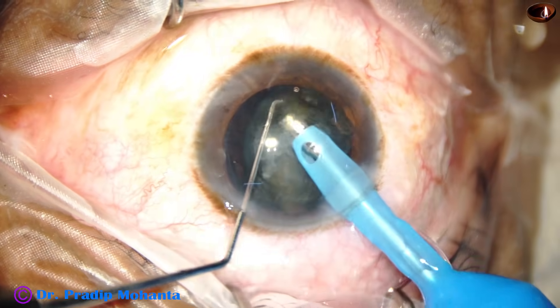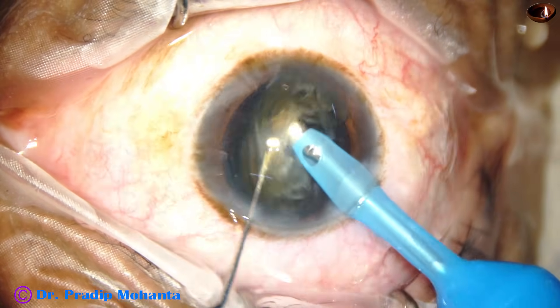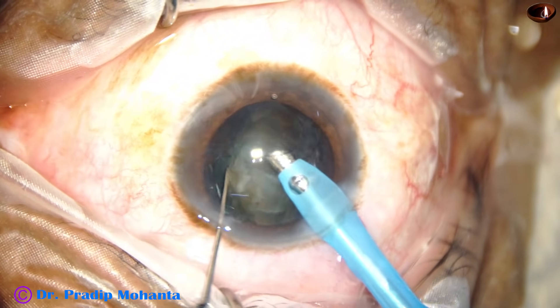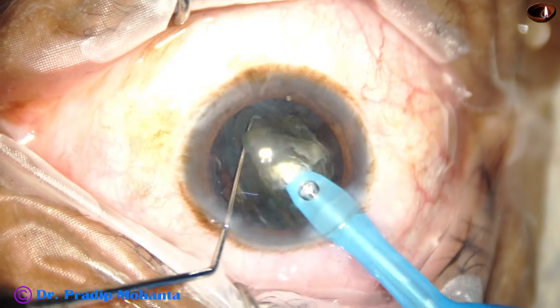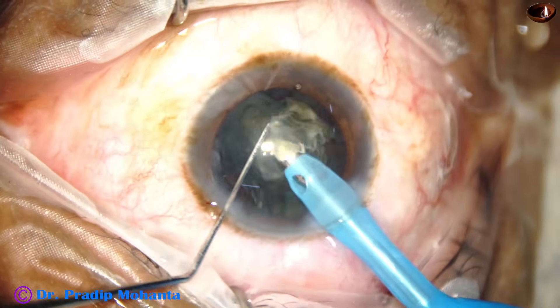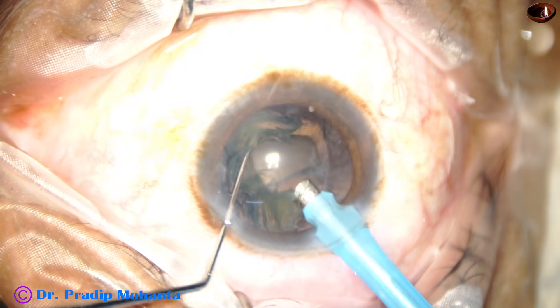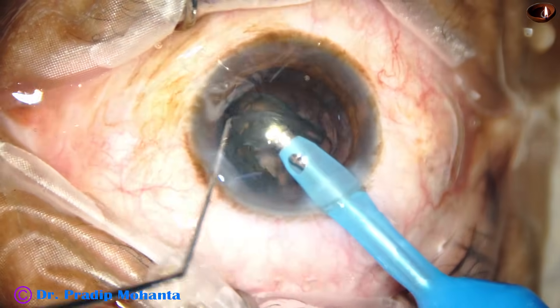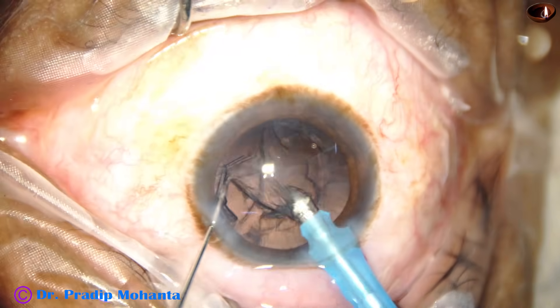Most of the nucleus has now been removed. I am trying to eat out only the nucleus and keep the epinucleus, which will protect the posterior capsule. We can see this is the bowl-shaped epinucleus — it has protected the posterior capsule. Now, very gently with low vacuum and low energy, we remove the epinucleus.